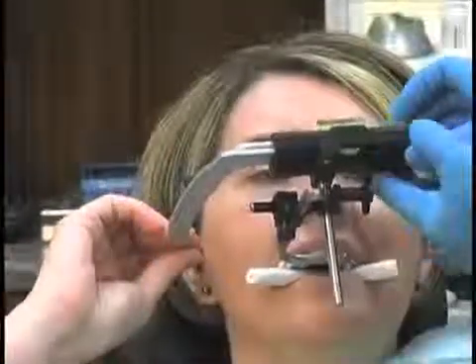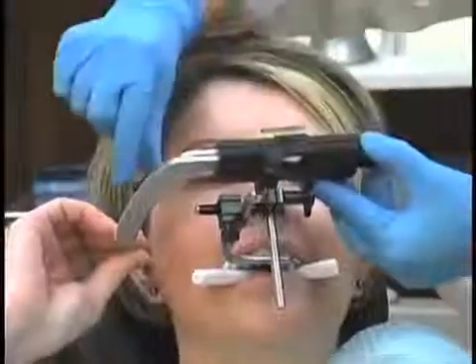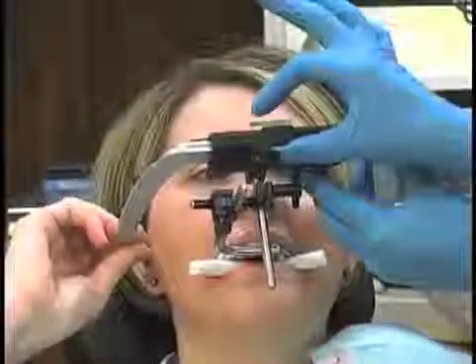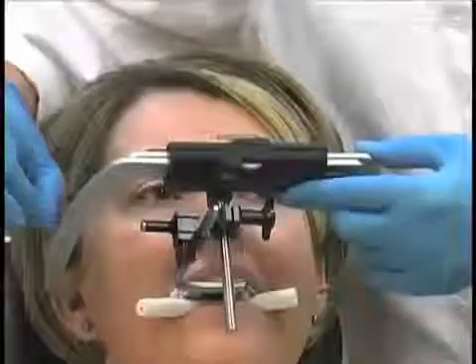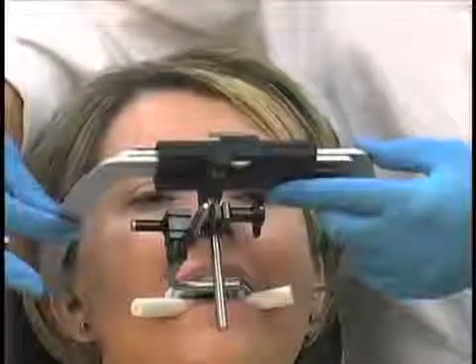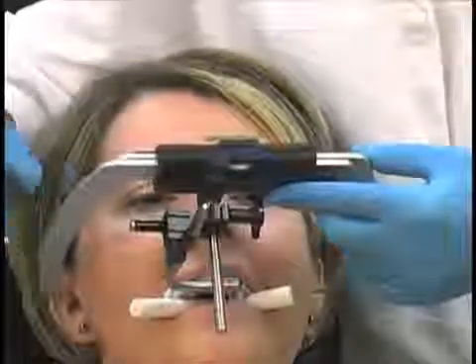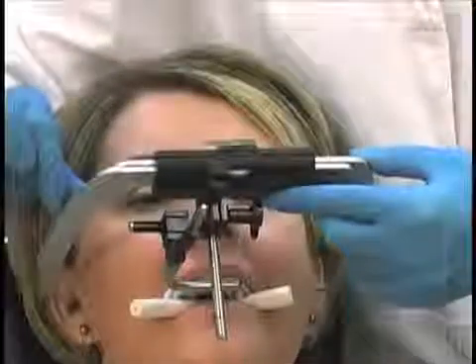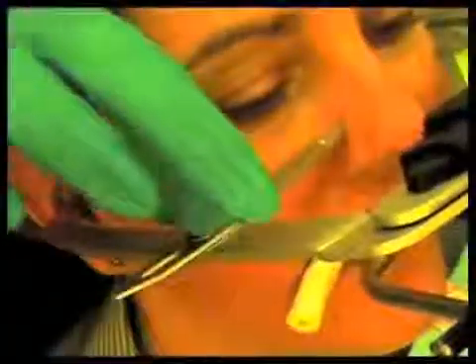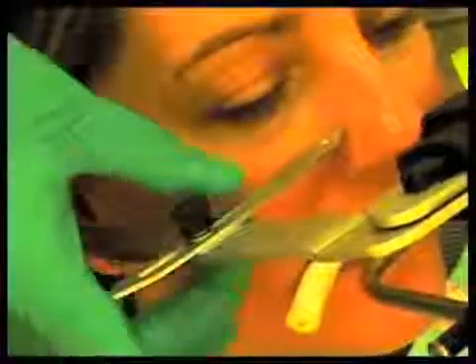Now notice what's happened here is the Facebow is now on their face, and the bite fork is attached to the maxillary arch, and so we have some of the basics here. Now one of the most important aspects of this procedure is now aligning the infraorbital pointer to the previously placed red dot on the lateral aspect of her nose. This is what's so critical about this Facebow, because this will center your cast on the articulator every single time. It's really so simple, but unique to the system and just makes it great. So we're going to go ahead and get that attached.